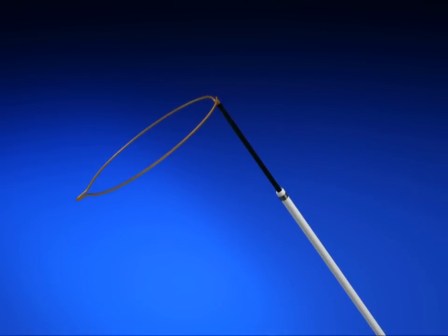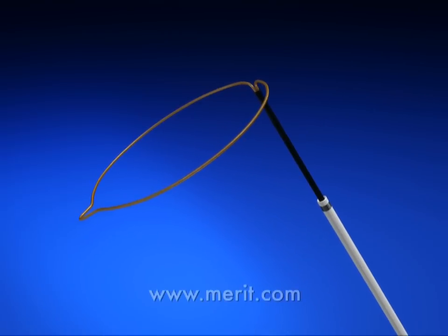To evaluate the One Snare Endovascular Snare System, contact your local Merit Medical Sales Representative or visit Merit.com to learn more.